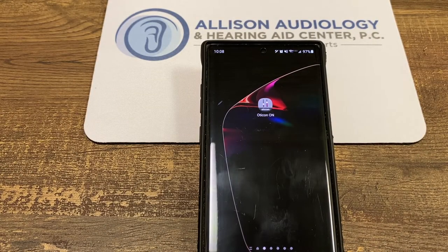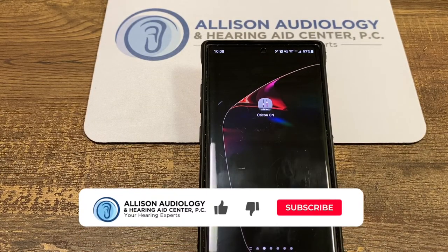Today we're going to be talking about how to pair the new Oticon hearing aids to an Android phone. Relatively easy.